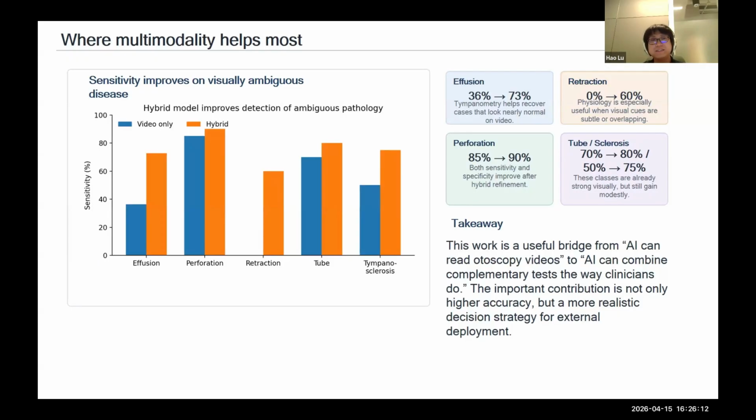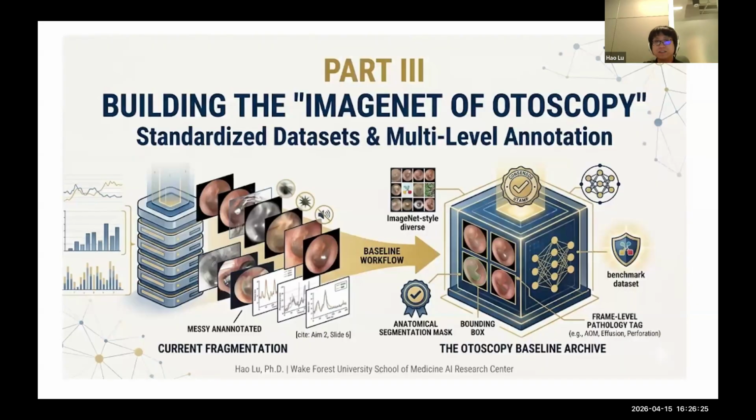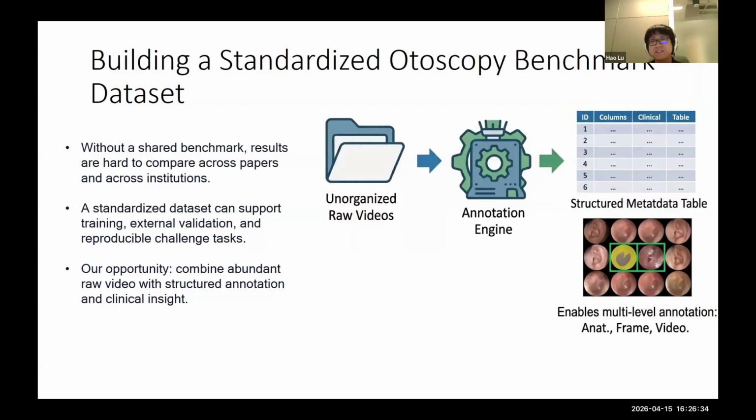Okay, this is the core breakdown and the core technique of our current research we have already done. So here I will introduce some work we are currently doing. As I mentioned, currently all the public otoscope data sets are very small and only come from a single center.